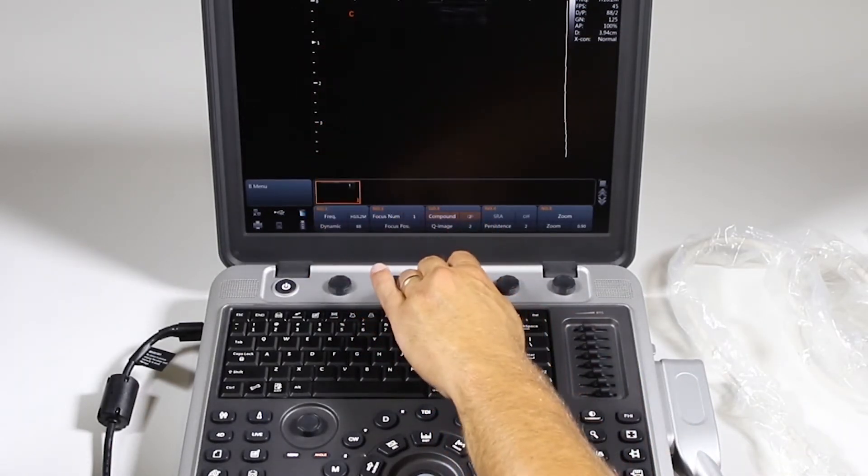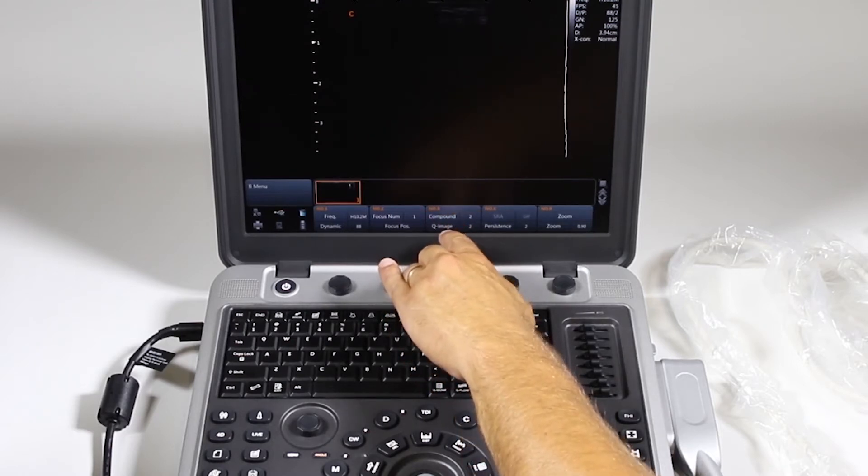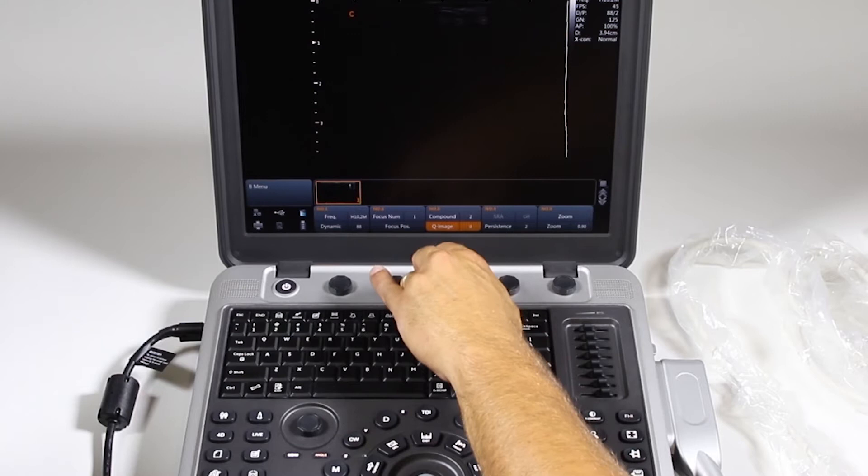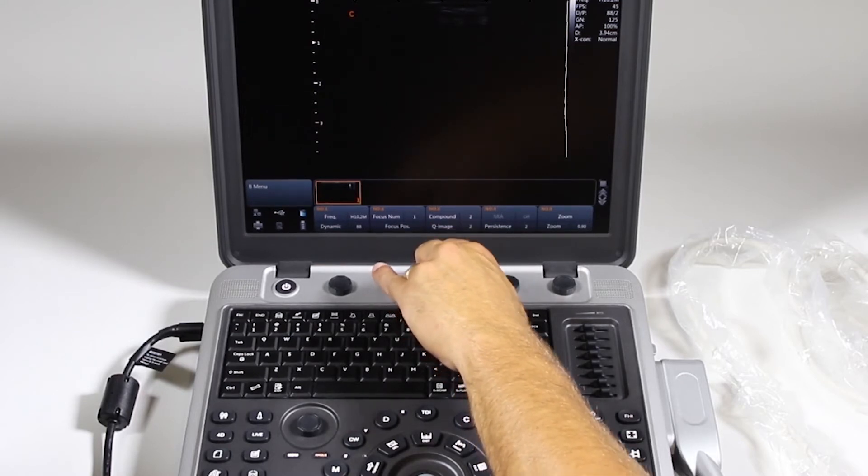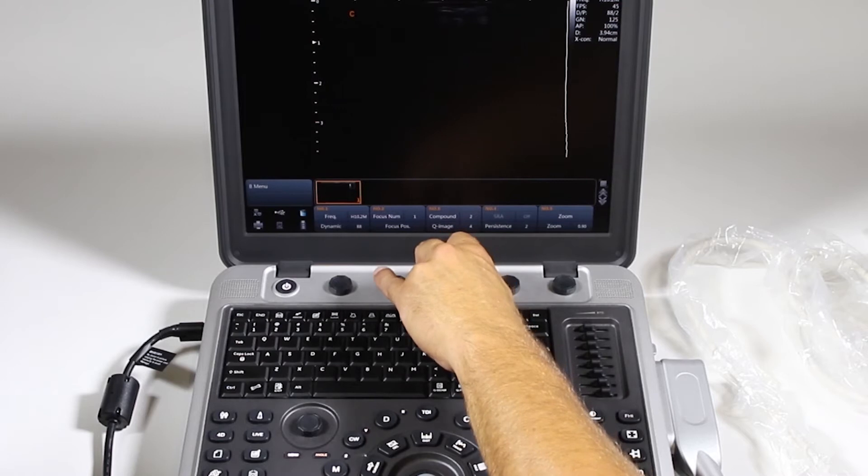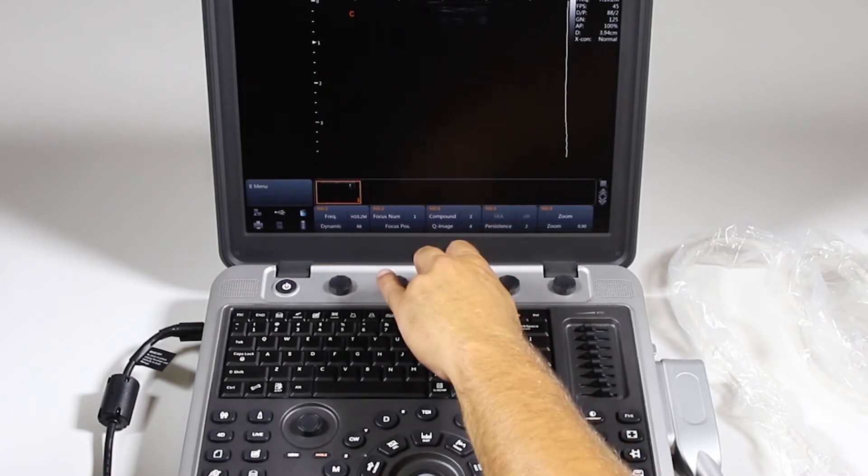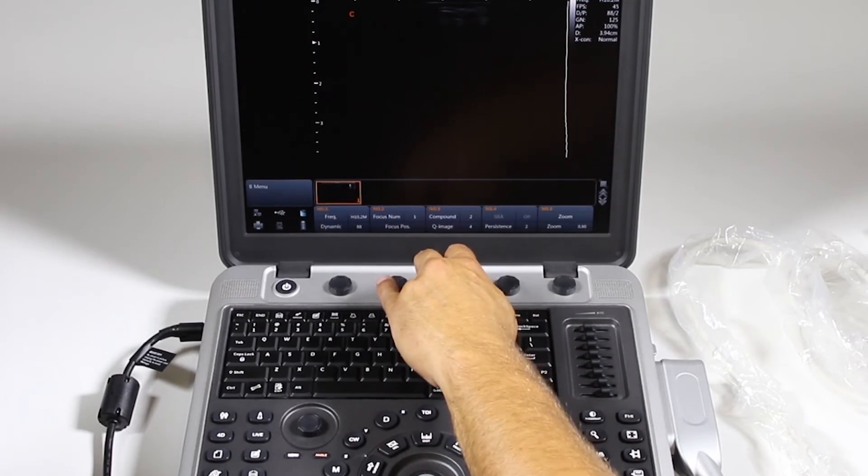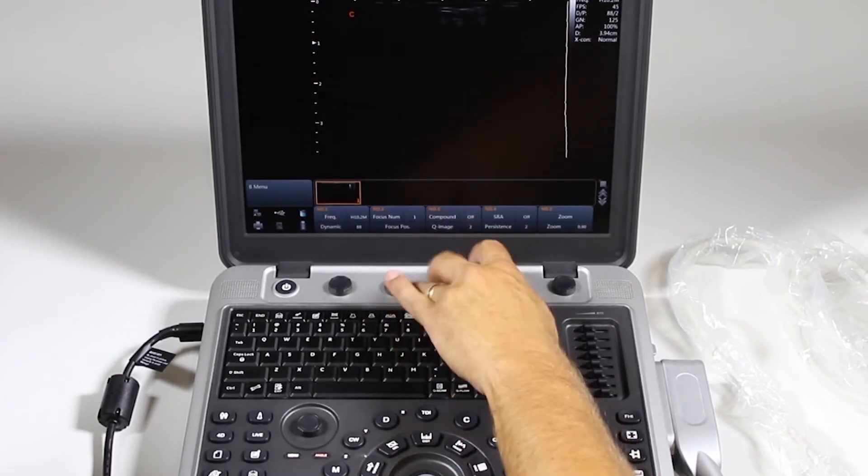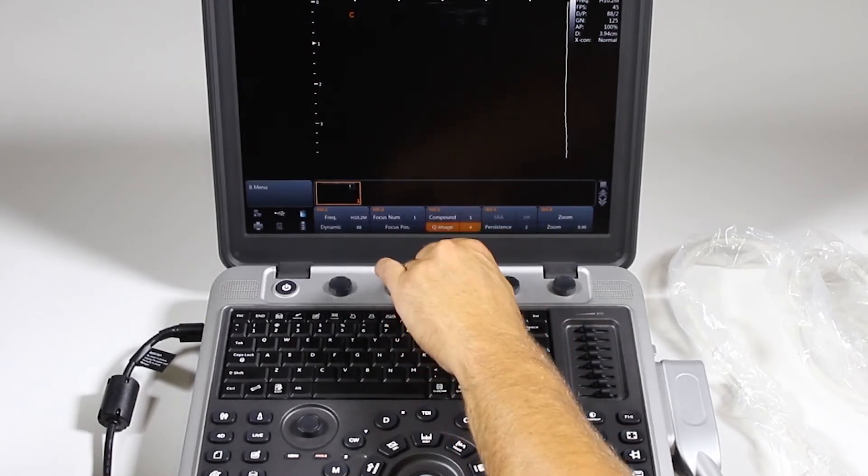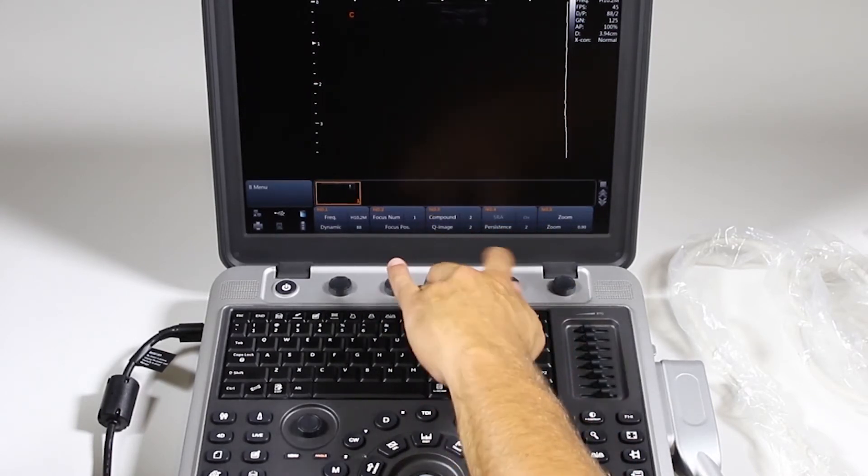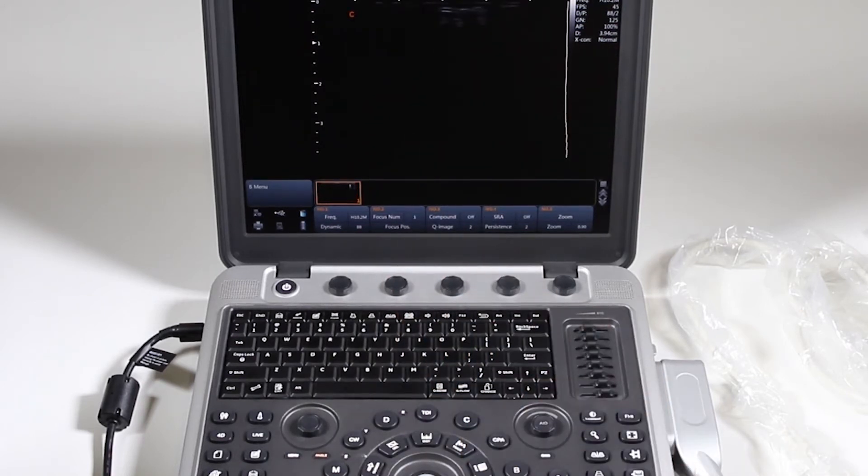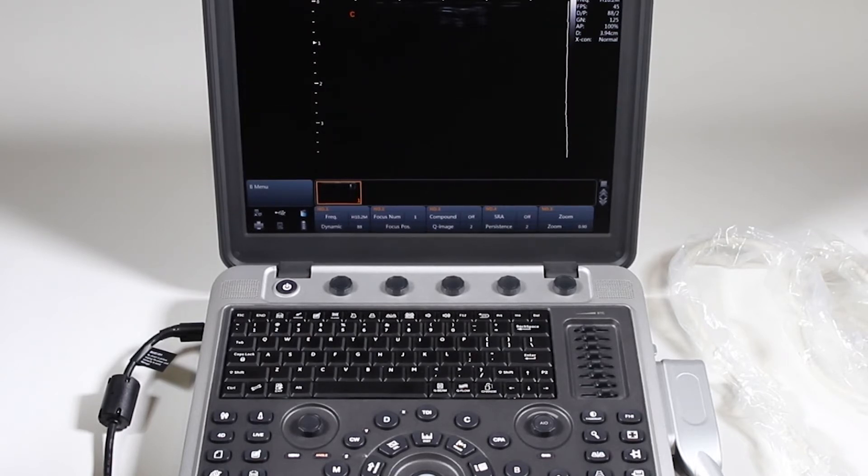Compound imaging, I can turn it off and add or remove lines of sight. Q-image is an image optimization where it's an automatic optimization with different settings that are programmed by Chison. Speckle reduction imaging, you'll find that on or off by default. In order to turn speckle reduction on, you're going to need to turn compound off. Speckle reduction on, and then you can go back and turn on the compound imaging. So you might want to try that as an image optimization. It can make a big difference in your image with speckle reduction on or off. And if you do like it, you can always save that as a custom preset.